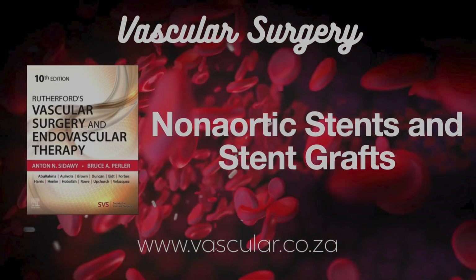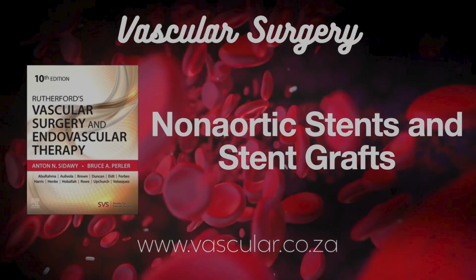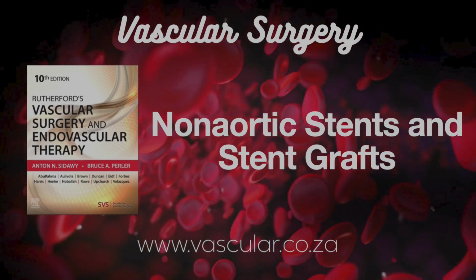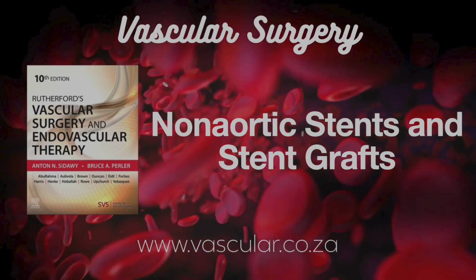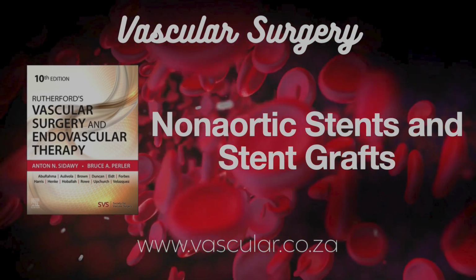Good long-term results generally. Unless the blockage isn't plaque, but compression from a ligament, the median arcuate ligament. Stenting doesn't fix that. You usually need surgery to release the ligament.